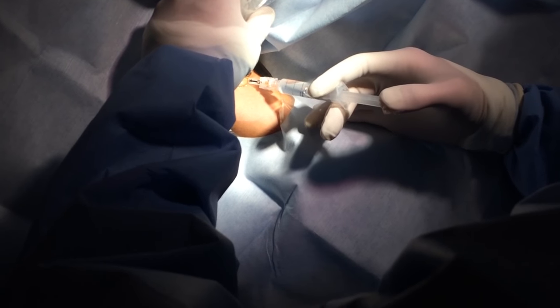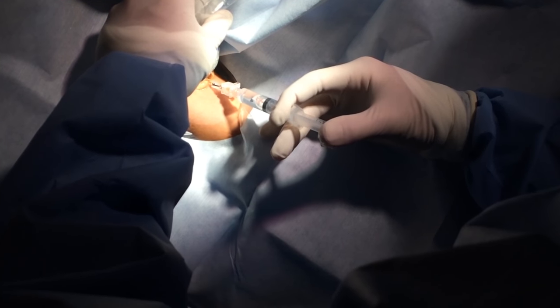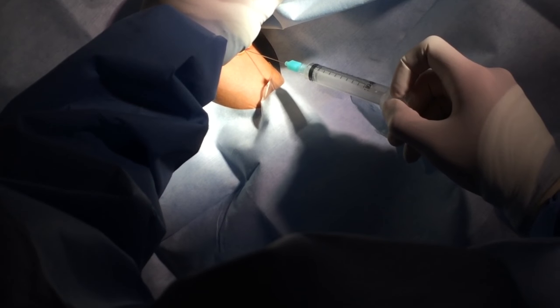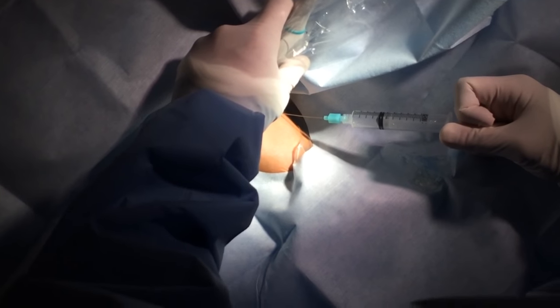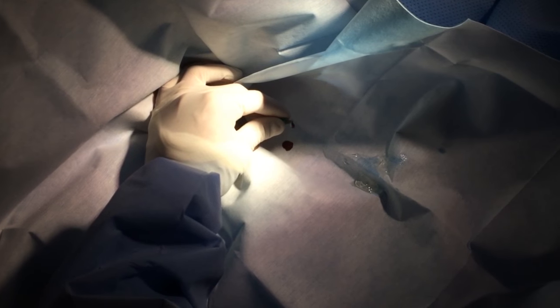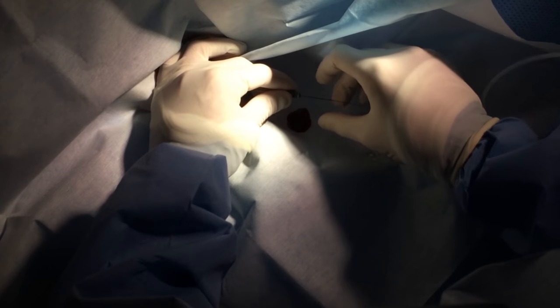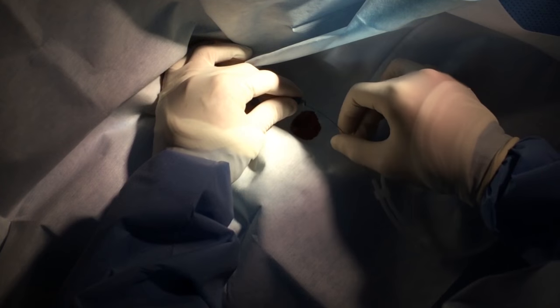So Rory's injecting again with half of the lidocaine syringe — we're saving the other half for later when we actually do the dilation. There's the ultrasound. Here comes our nice big introducer needle, looking on the ultrasound. And there it is — nice flash. It's still going; we know we're patent in the middle of the vessel. So we'll put that floppy wire in and advance about halfway of the wire, going nice and smooth and easy.